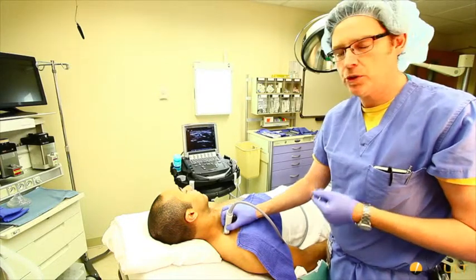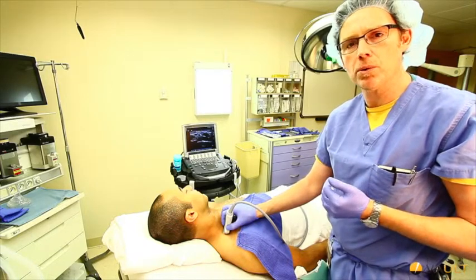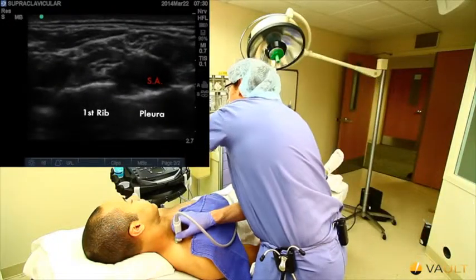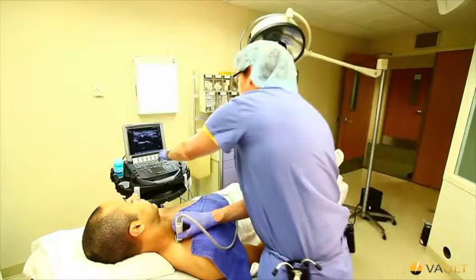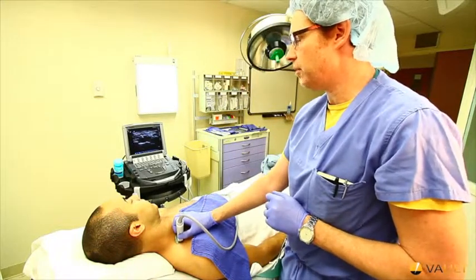One of the ways we can reduce the incidence of pneumothorax is ensuring that the first rib lies over the pleura and inferior to the subclavian artery. The pleura, as you can see, is a fine hyperechoic line with what we call comet tails. You can see the tail streaming down into the pleura, and you can actually see the pleura moving as the patient breathes in and out.